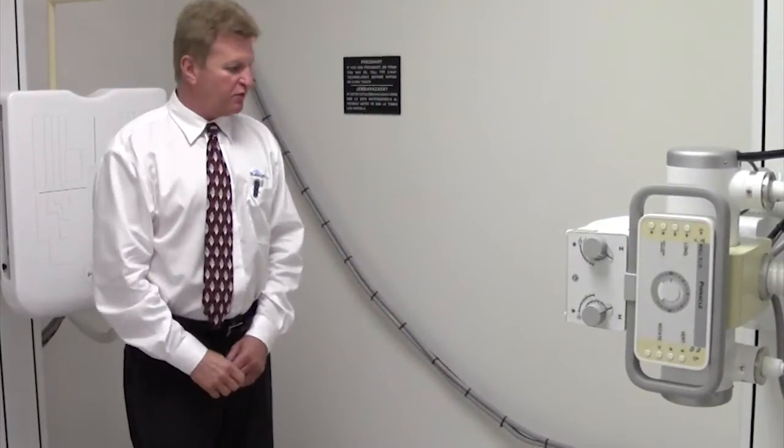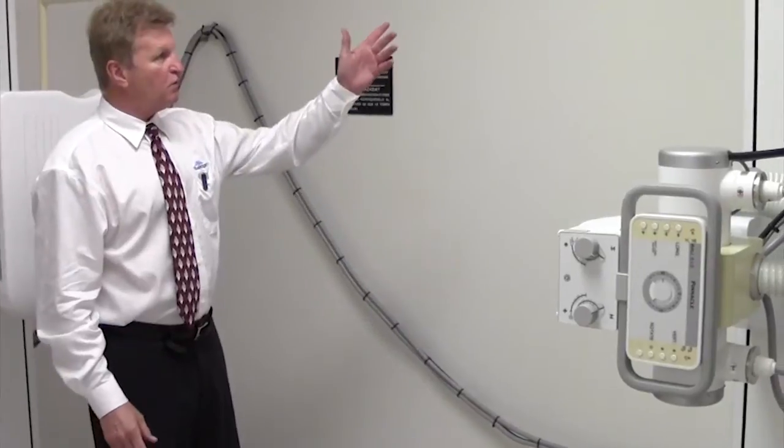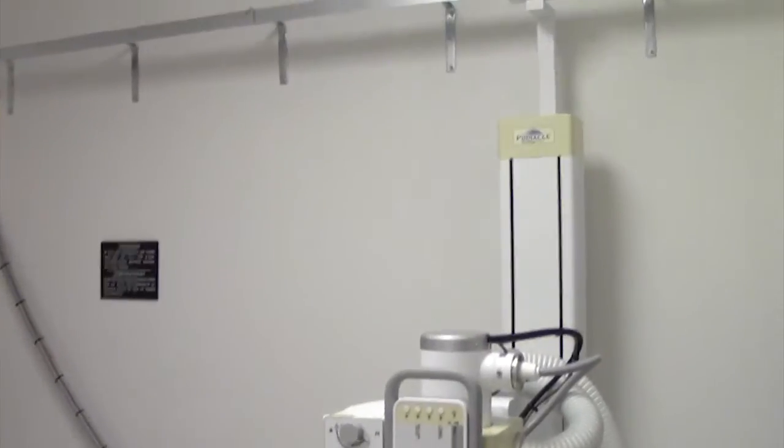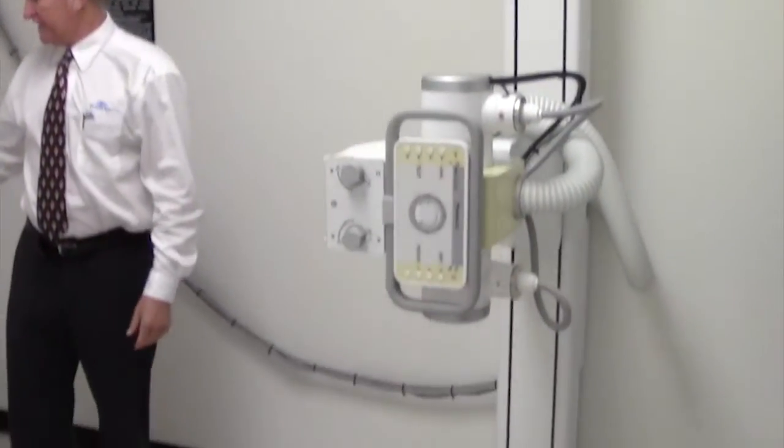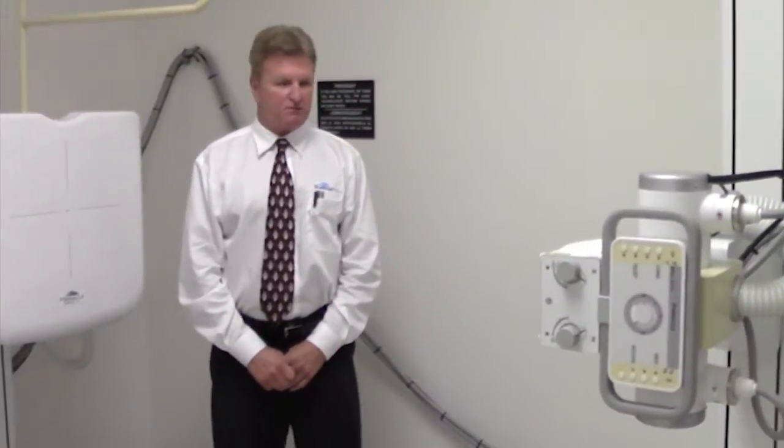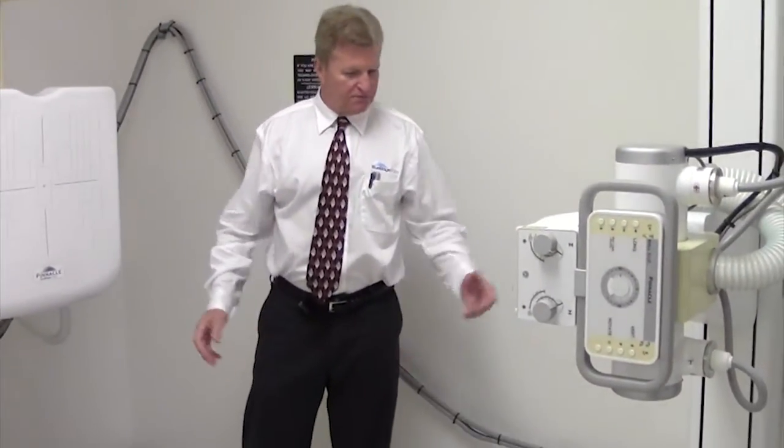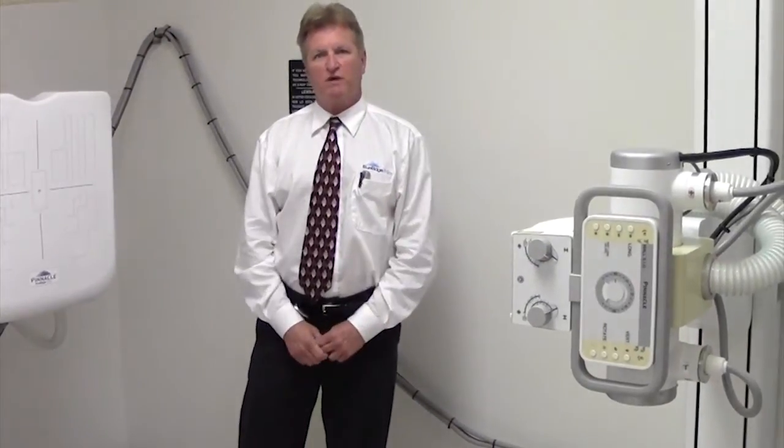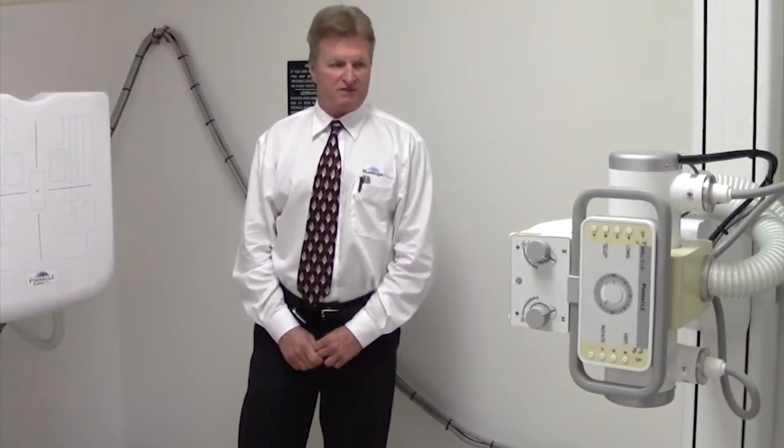It can go in a very small space and you'll notice that the floor-to-wall tube stand and the floor-mounted tilting wall stand are independent of one another. That gives the flexibility of doing certain images as well as being installed in smaller spaces.